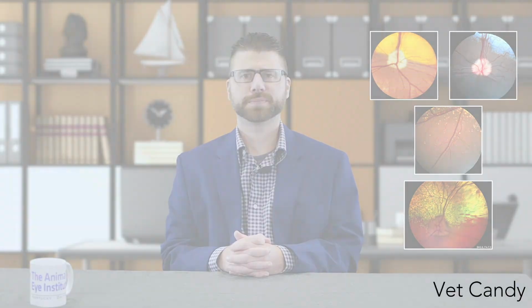And these are all normal variants with these photos, but there's less of a range in cats than there is in dogs. The canine non-tapetum also has a variety of normal variants. It's not as wide a range as the tapetum, but the non-tapetum can also have different variants of normal.